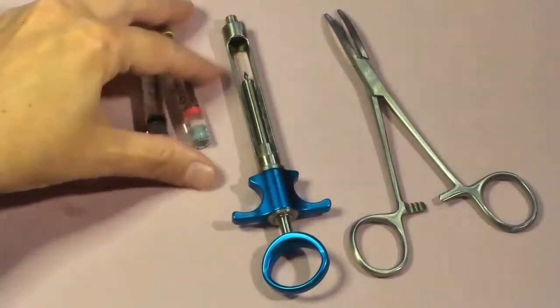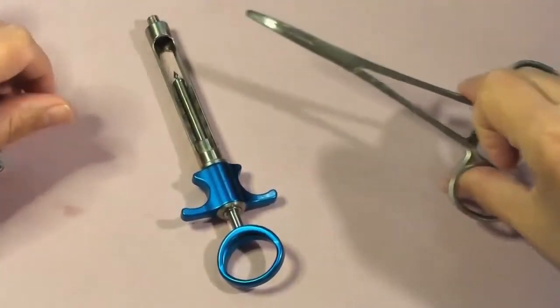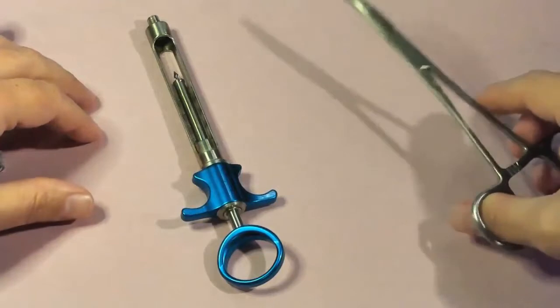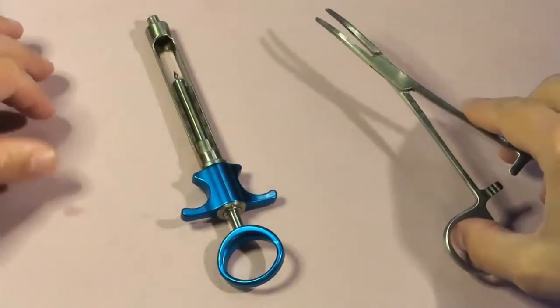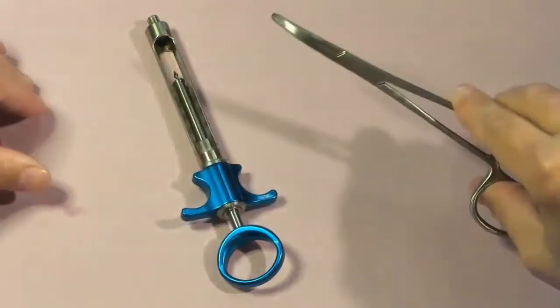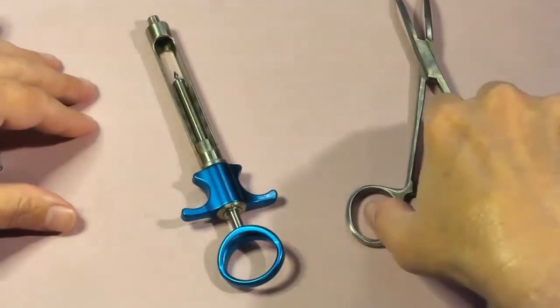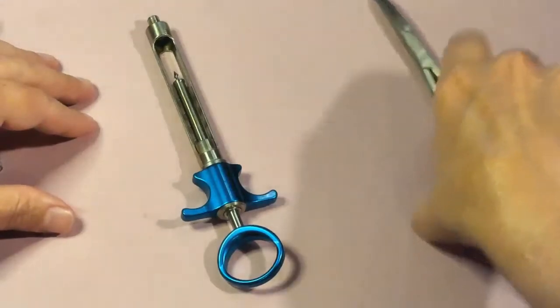Starting with the locking hemostat — we want a hemostat that will lock. You can see this one locks at the bottom, so it will lock closed. The reason that is significant is we use our hemostat in case of potential needle breakage in the tissue to retrieve the needle. We want it to lock tightly so we can grab that narrow diameter needle tip and pull it from the tissue.